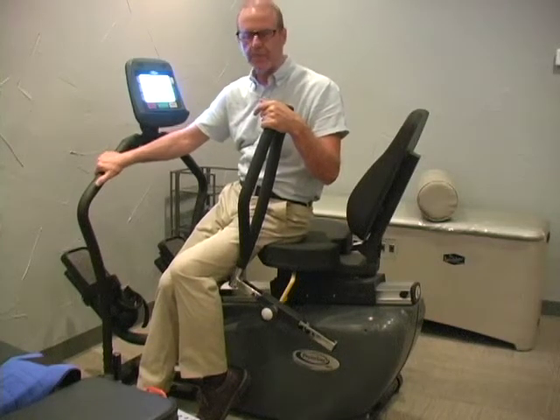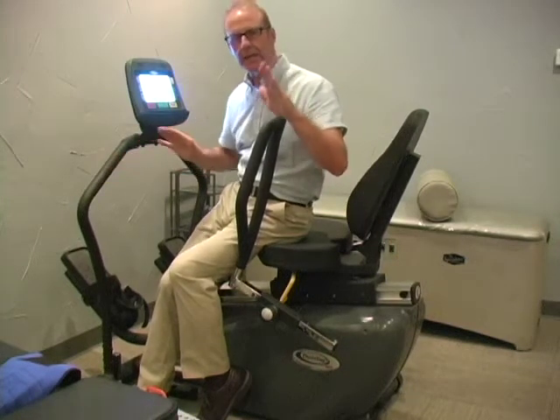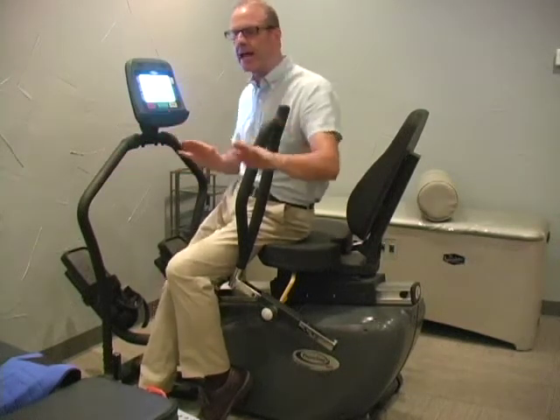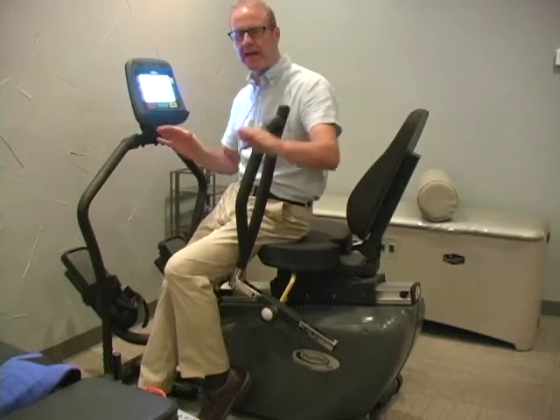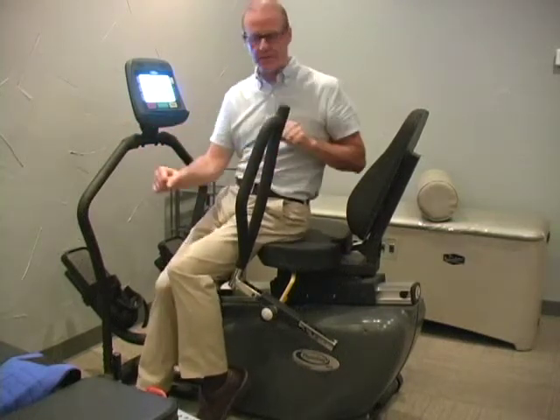This is the Physiostep Exerciser. It's a cross between an elliptical and a rowing machine, activating the leg muscles and upper body muscles.